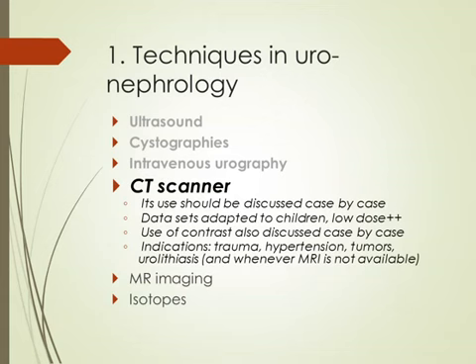Fourth technique, CT scanner. This is a really important and interesting technique. Its use should be discussed case by case. The data sets should be adapted to children to lower the doses as low as possible. The use of contrast has also specific indication and should be discussed case by case.